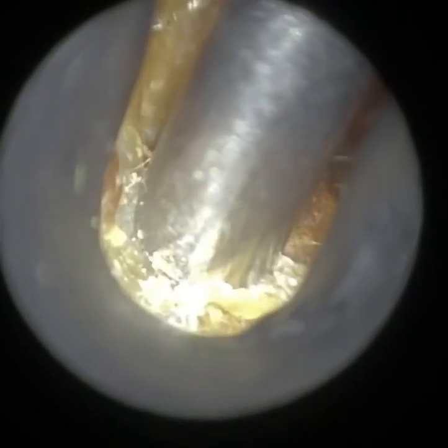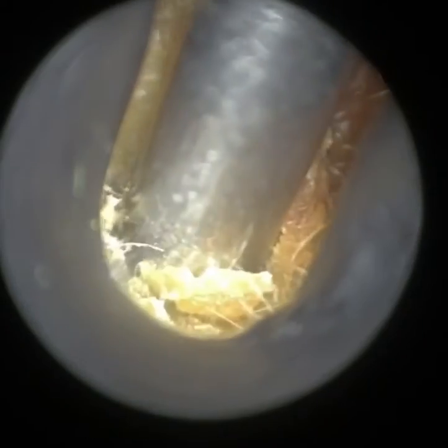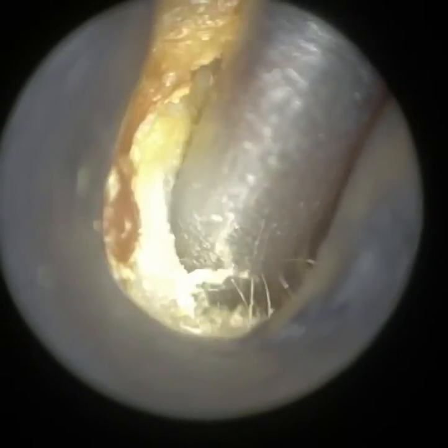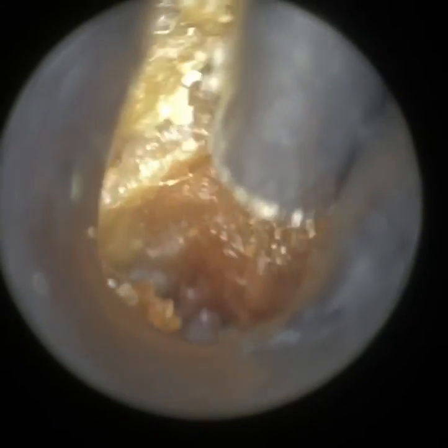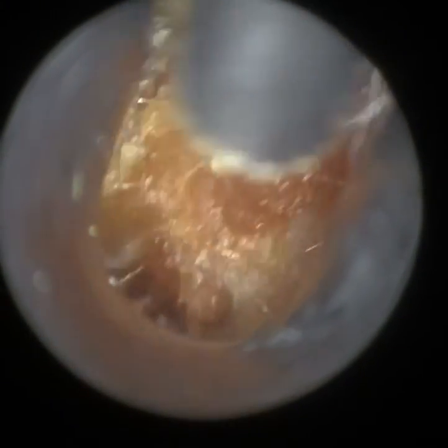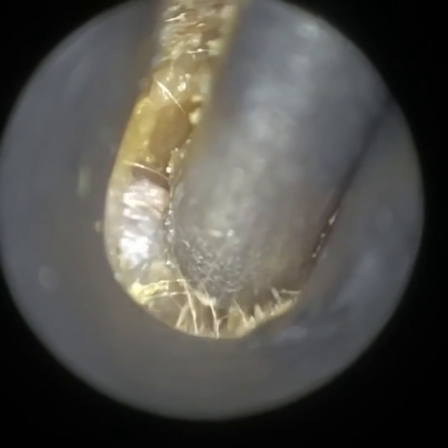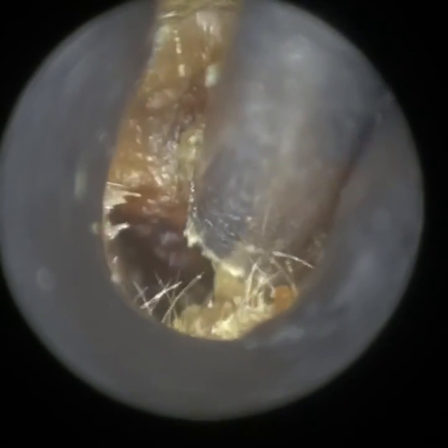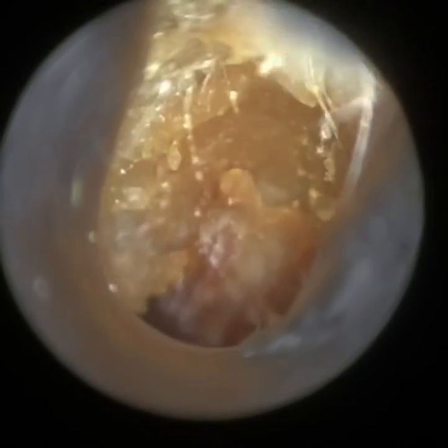We have a patient here — a young child, nine years of age — and they attend every six or seven months or so to have their right ear cleared. They have this buildup of very soft, glutinous earwax and dead skin. It can be a tricky consistency to remove, because when it's soft and mushy like this, it's very hard to get a suction grip — instead it blocks the inside of the suction probe.